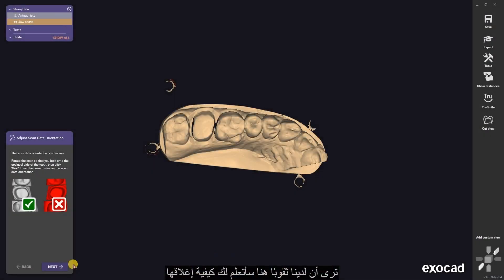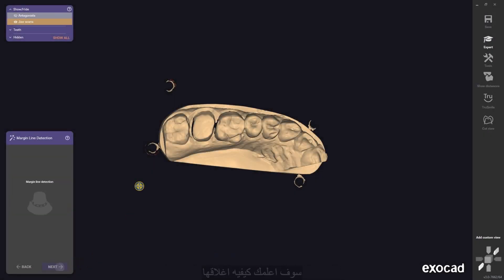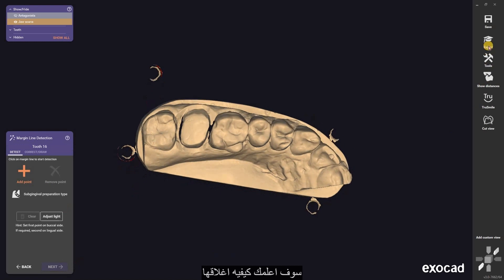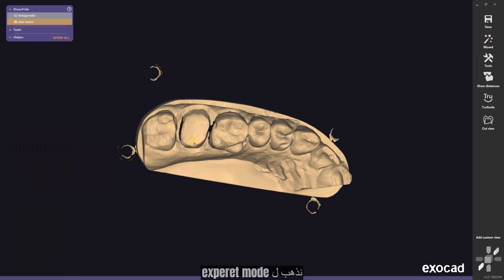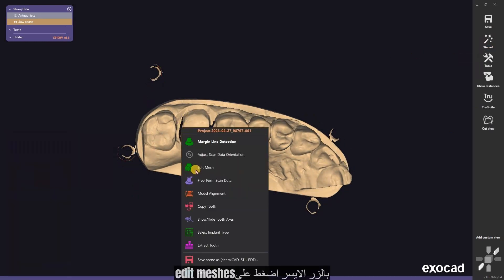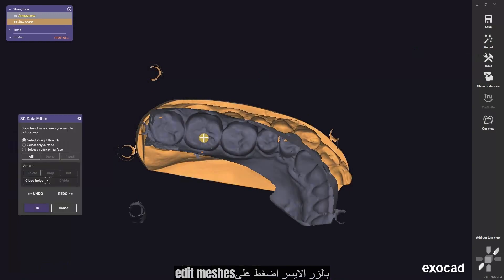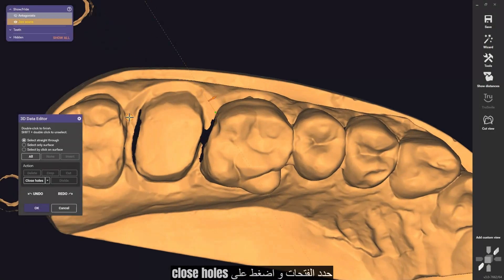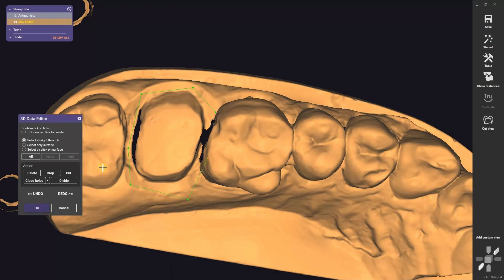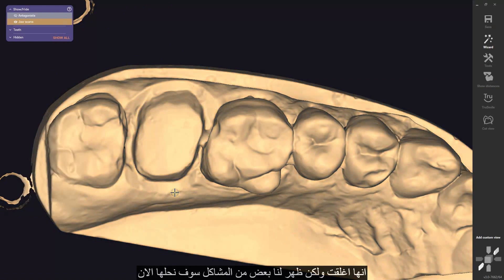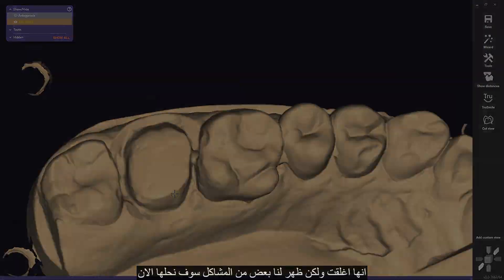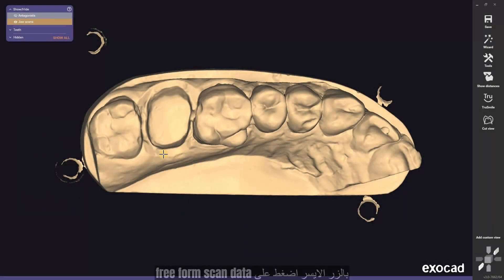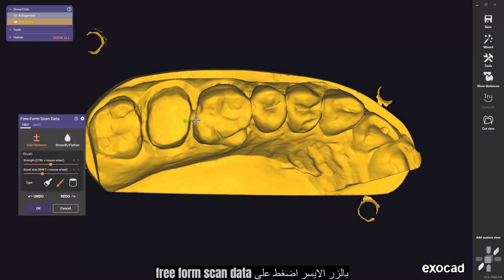You see that we have holes here. I will show you how to close them. Go to expert mode, press the right mouse click, go to edit meshes, select the holes, and click close holes.